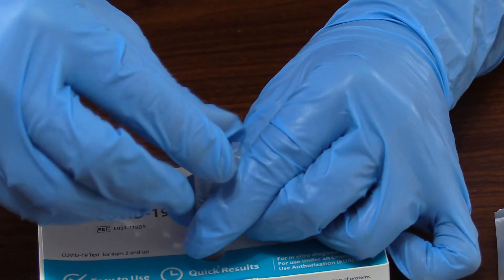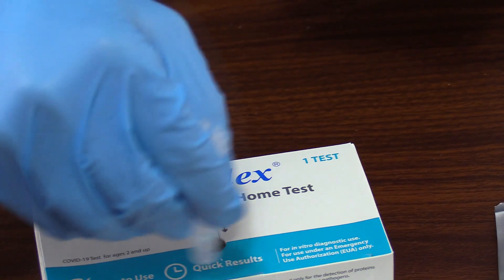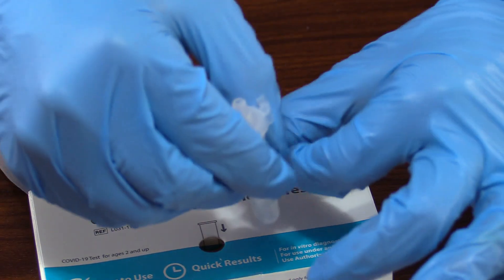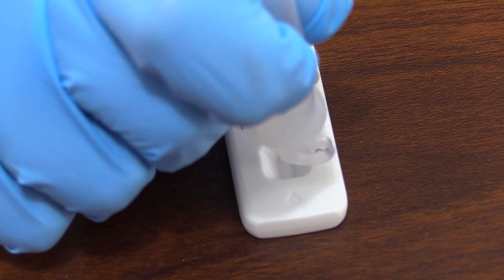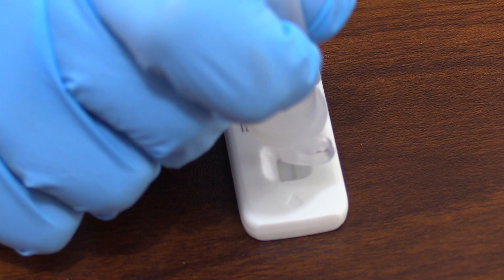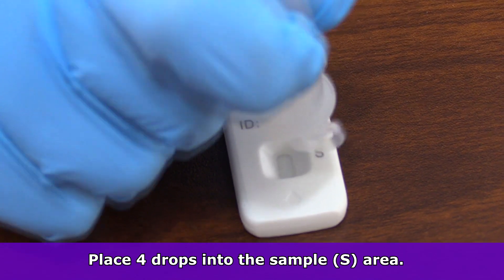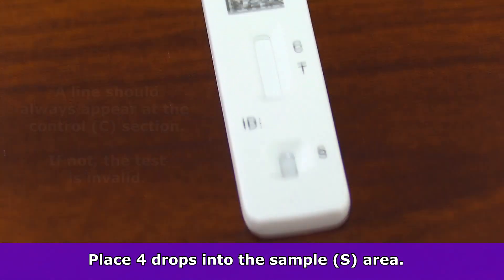Then attach the dropper tip onto the tube and mix the solution and your specimen in the tube by swirling it around or flicking the bottom of the tube. Now it's time to place your sample into the actual test cassette. You'll be dropping four drops of your specimen from the tube into the sample well.